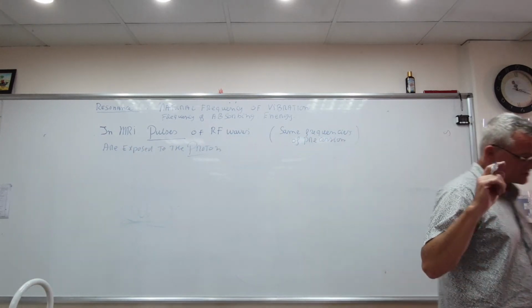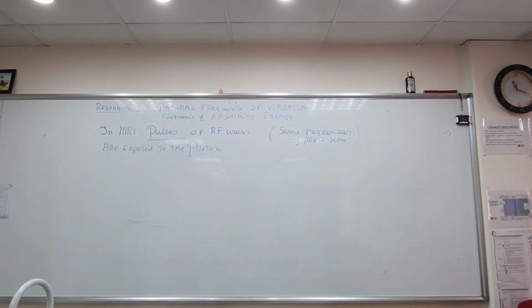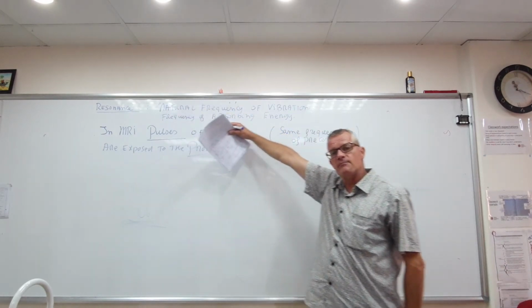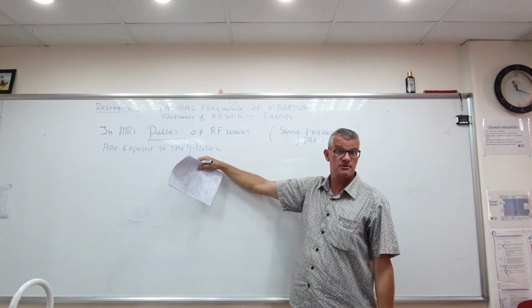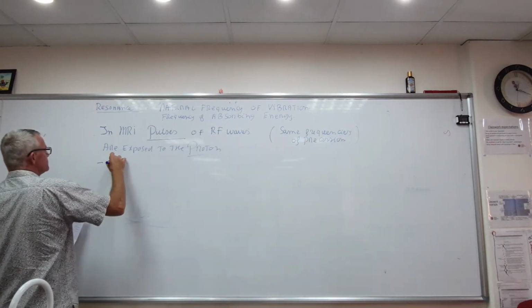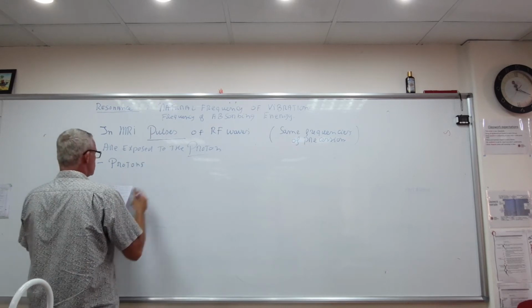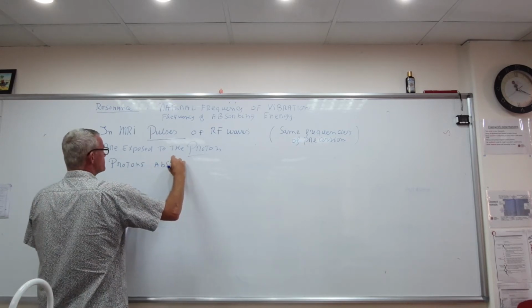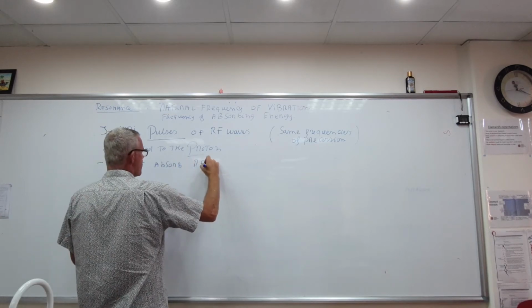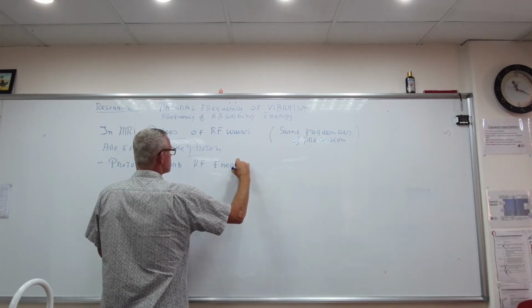Okay? So what will happen if you use the same natural frequency, which is the frequency of precession? Well, you get resonance, and that means the protons, they're going to absorb that energy. Yeah? So protons absorb RF radio frequency energy.